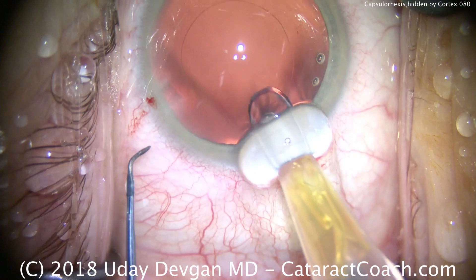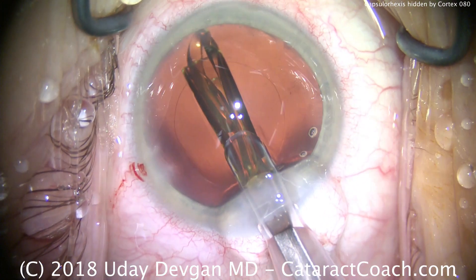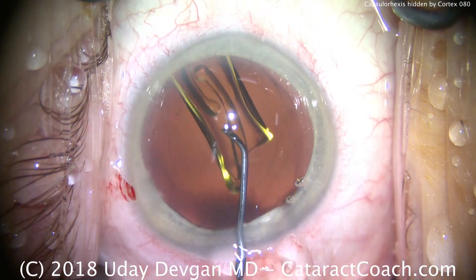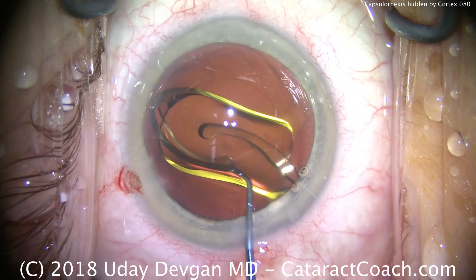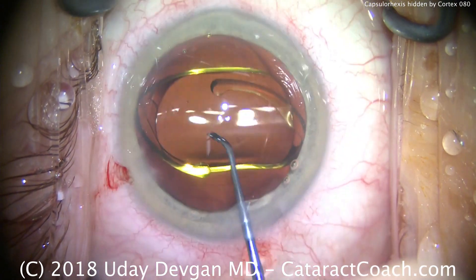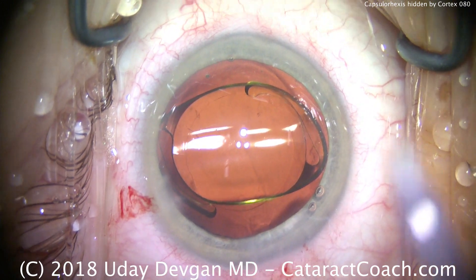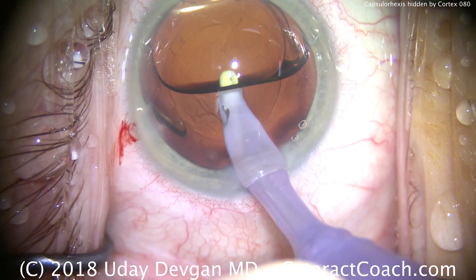The femtosecond laser is a fantastic tool for certain cases, and surgeons certainly use it quite a bit in our surgery center — I'm certainly not disparaging it; it's a valuable tool for the right surgeons in the right cases. Here comes the lens being unfolded. I do use the femtosecond laser for certain cases, but in this particular case the patient really couldn't afford the additional fees, and I told her it was no worry — we'd still be able to do a beautiful job for her.